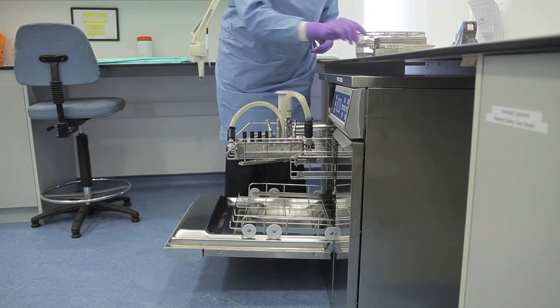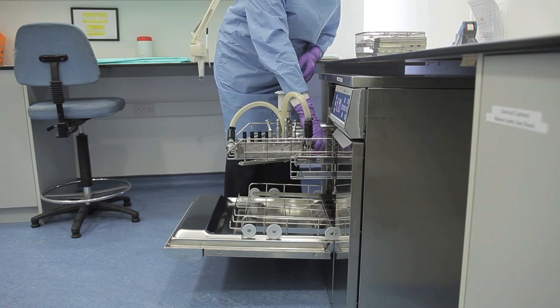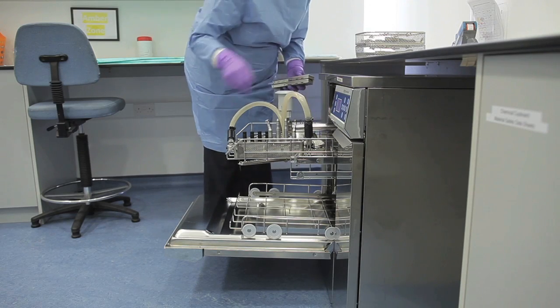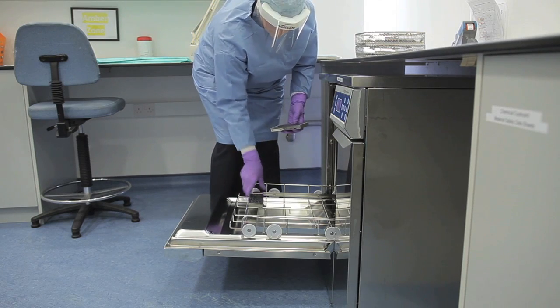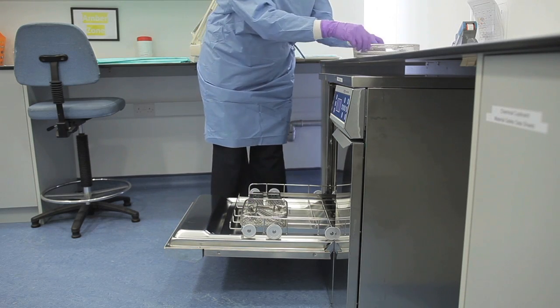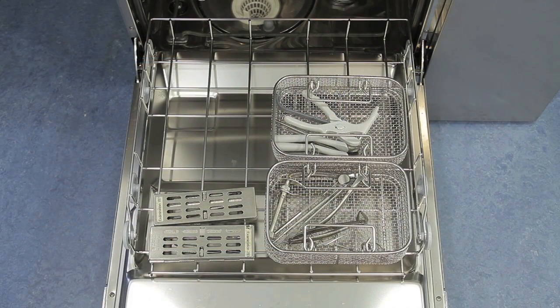If using RIMD cassettes in the clinical area, load the cassettes into the washer disinfector without stacking them on top of each other or overloading them. Ensure there are sufficient gaps or holes in the cassette to allow the water and detergent to clean all the RIMD and internal areas of the cassettes. Use of cassettes is preferable to minimise instrument damage and reduce the risk of percutaneous injury from handling of contaminated RIMD. Single RIMD, for example a Coupland's chisel, should be placed in a metal meshed basket in the washer disinfector.